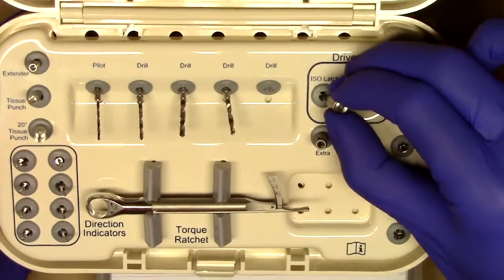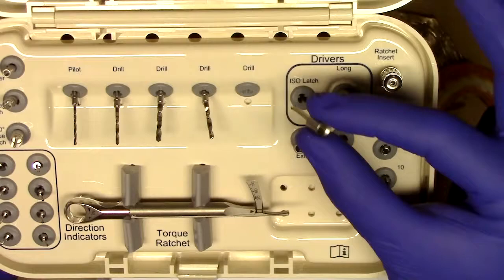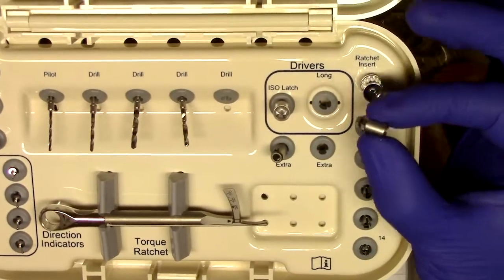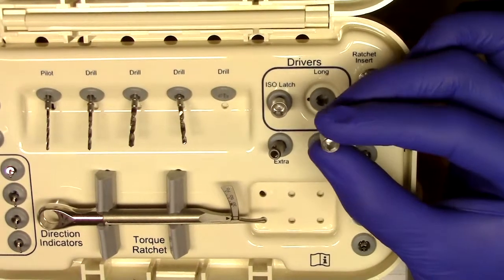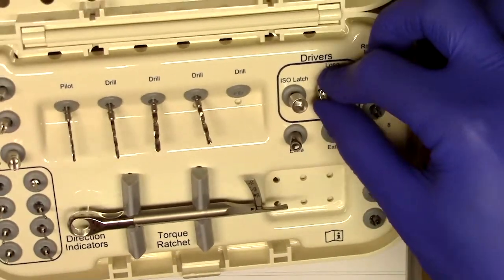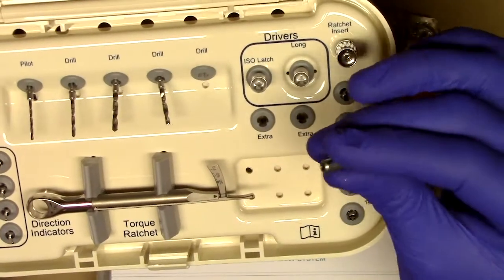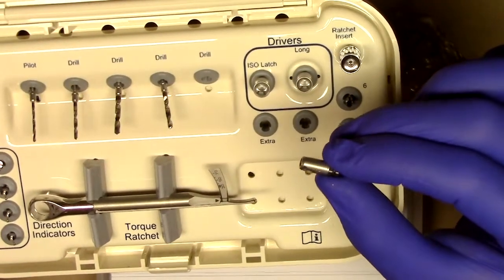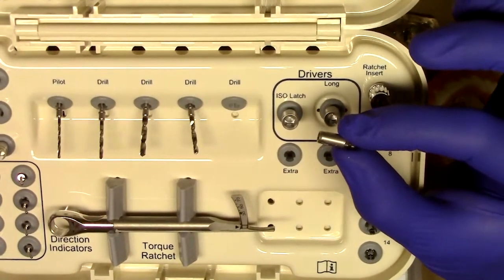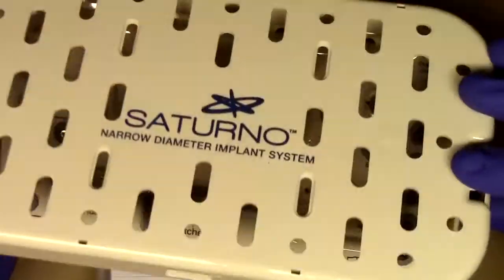For your straight Saturno narrow diameter implants, we have an iso latch driver that will go into your handpiece. And then also for the manual insertion of the straight Saturno implants, we have the driver that goes into the manual torque wrench. We also have a direct driver, which is used for finite and very detailed positioning of your angled Saturno implant. That describes our surgical kit.